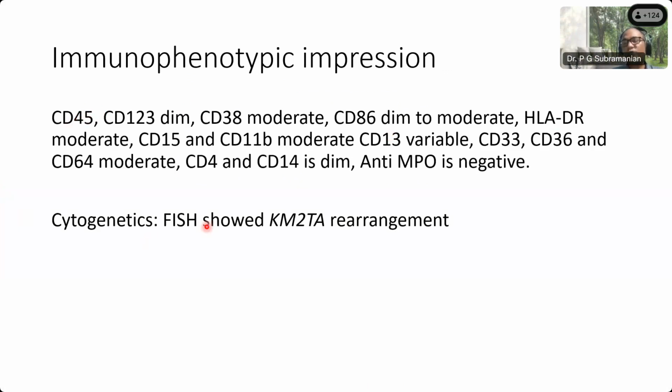Cytogenetics: though NG2 was negative, in this case the cytogenetics is positive for KMT2A rearrangement. So we have had the second case. One case is an ALL, this case is an AML. So KMT2A rearrangement was positive in this.